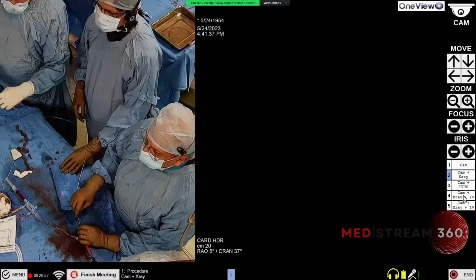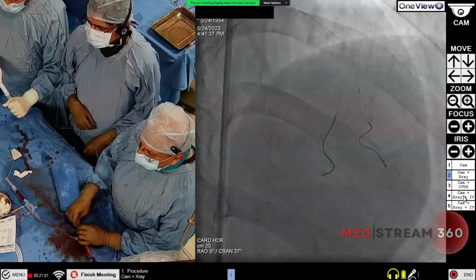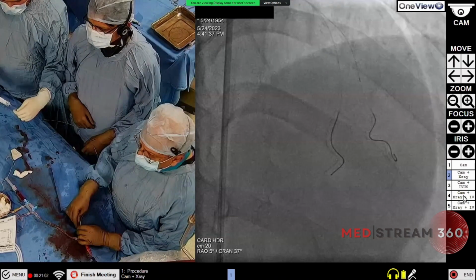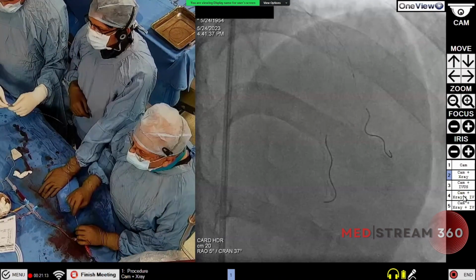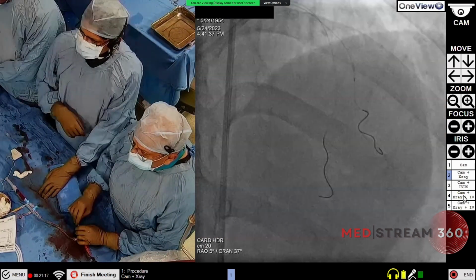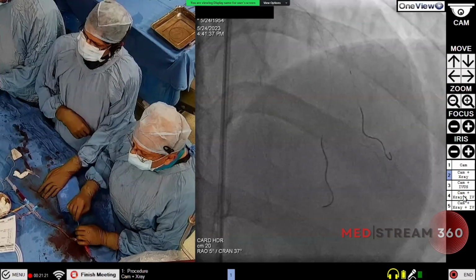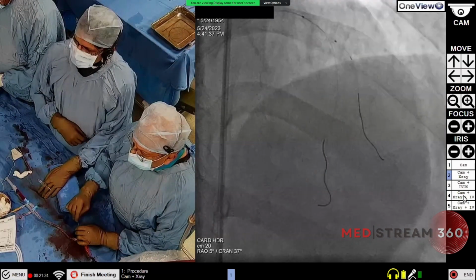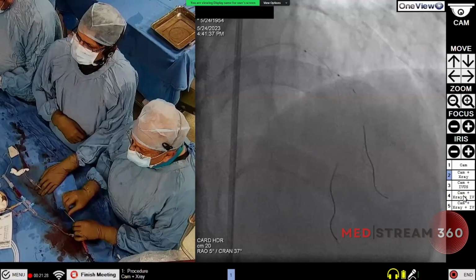We are trying to treat this vessel as best as possible and do a good angioplasty. That is why the FFR wire is kept in the LAD, to see once we have dilated and done everything: if flow is good and the FFR value is okay, chances of thrombus formation are very low, and we can safely leave them without putting a stent.